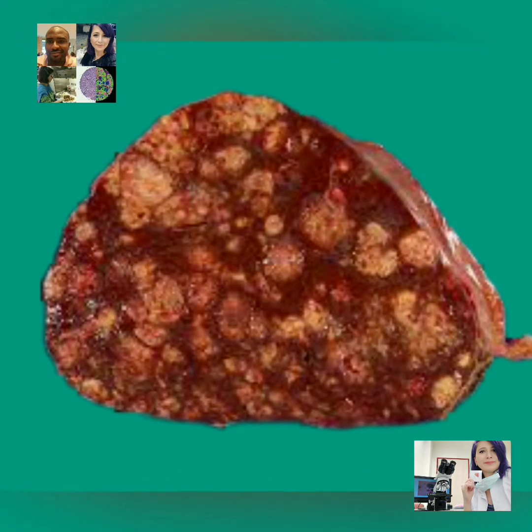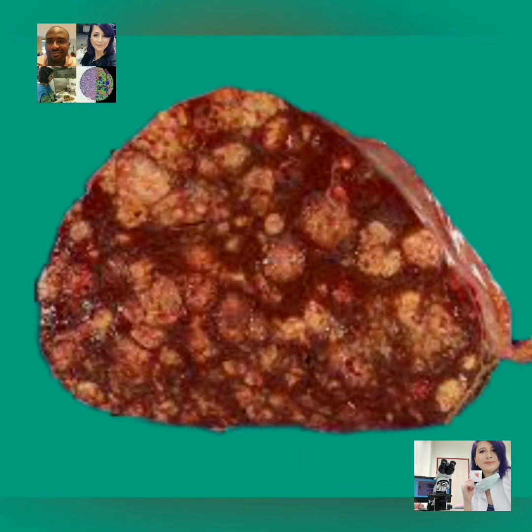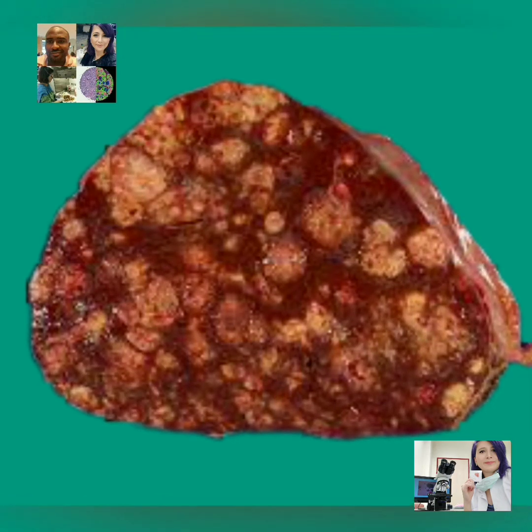Key things to note are if there are areas of cirrhosis, fibrosis, fatty change, or chronic congestion, which will present as a nutmeg appearance.